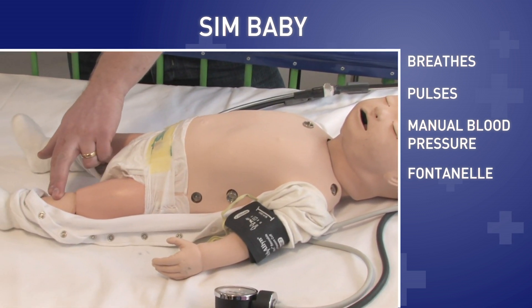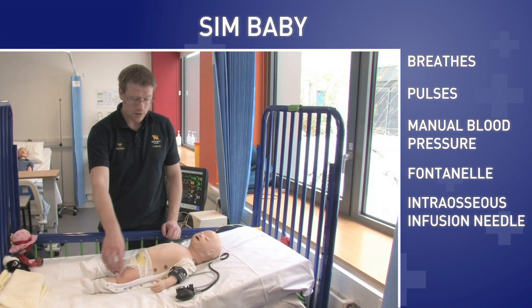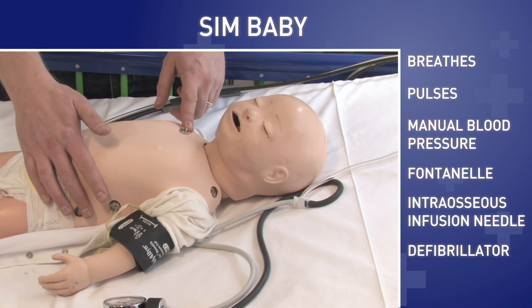Also on both legs you can put an intraosseous needle to give him fast-acting drugs into his legs. You can also use a defibrillator on him, so if he goes into a cardiac arrest you can give him a real shock.